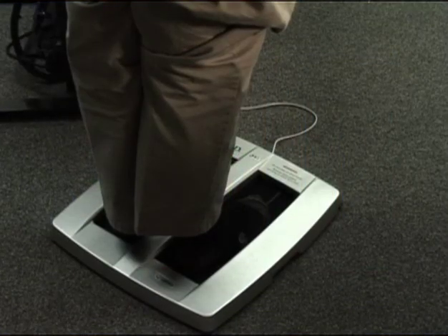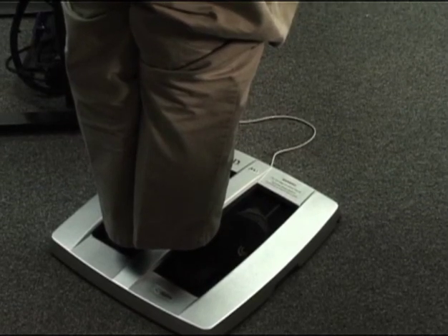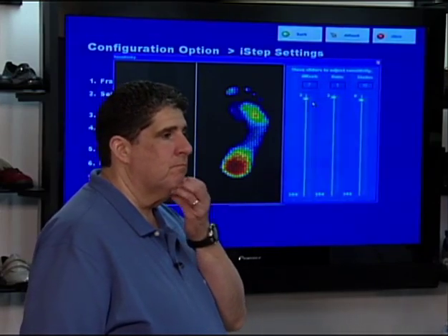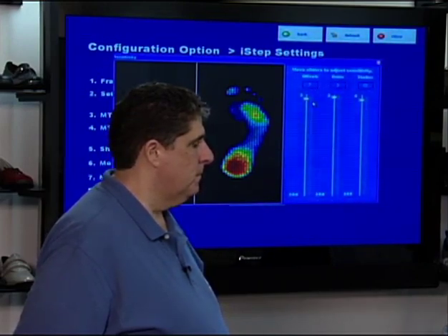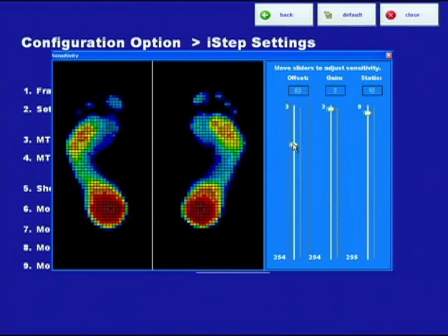You can see the other extreme — if I go down to zero or to 12, it's a little too cool. So we have standards used in our I-STEP department to get it to where we think it's optimum in terms of pressure sensitivity. You'll notice you have to move this to see the sensitivity change. You'll get it to where you think it's about right. So that does the sensitivity — the offset — which is the primary way to adjust the color.